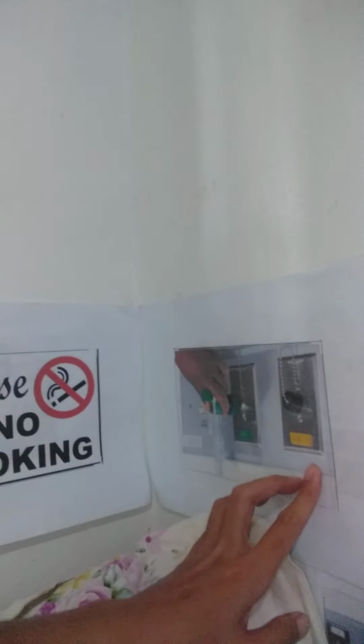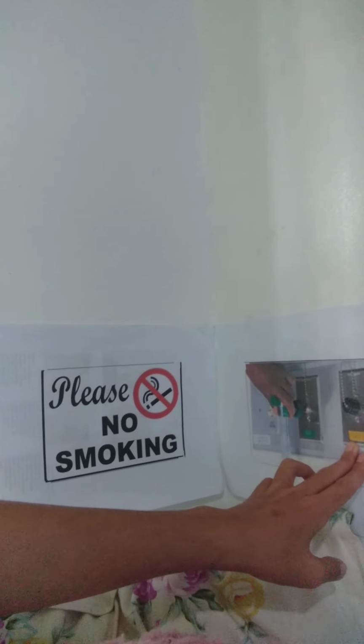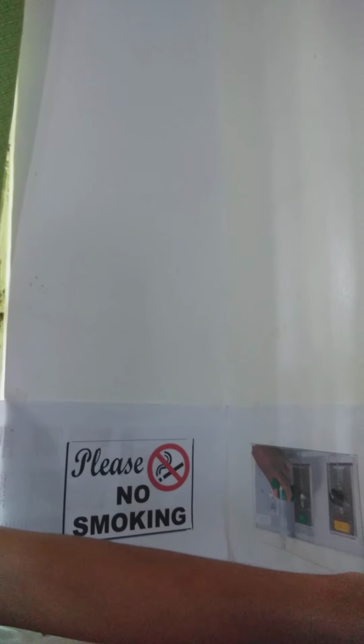And here are our no smoking sign, our flow meter, oxygen tank or oxygen delivery system, and then we have the flow meter and the humidifier, and we have the nasal cannula and the tape.